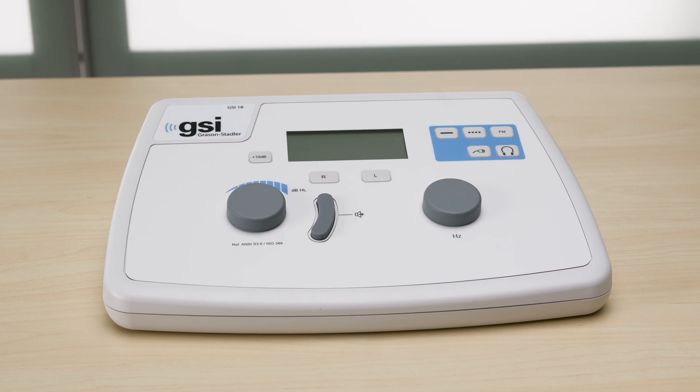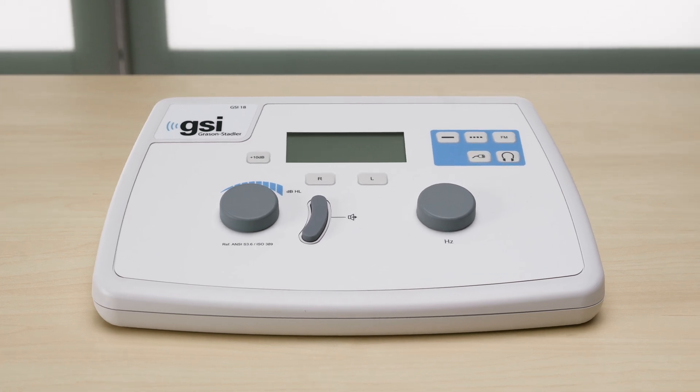Thank you for taking the time to watch the GSI 18 tutorial. The GSI 18 is a single channel air conduction screening audiometer. It features a frequency range of 125 to 8,000 Hertz and an intensity range of up to 100 dB HL. The GSI 18 includes everything needed to perform pure tone screenings in any environment.